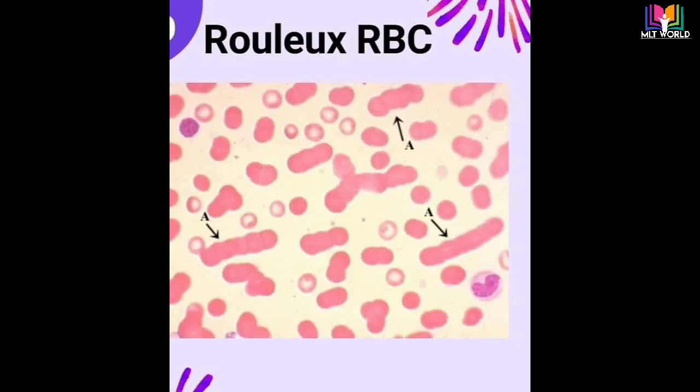Next is rouleaux RBC. Rouleaux are stacks or aggregations of red cells that form because of the unique discoid shape of the cells. What causes rouleaux: when rouleaux formation is truly present, it is caused by an increase in certain proteins such as immunoglobulins and fibrinogen. To confirm rouleaux formation, it is better to try one more smear to confirm, because sometimes if the smear is not made properly, rouleaux formation can appear as an artifact.